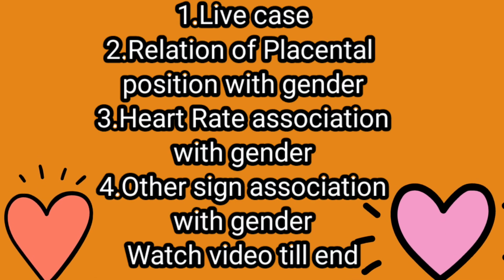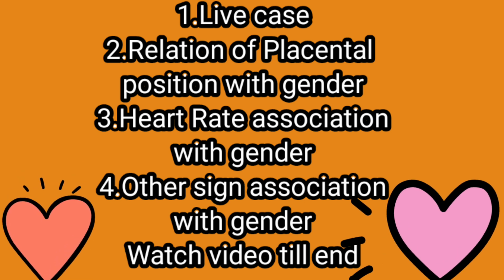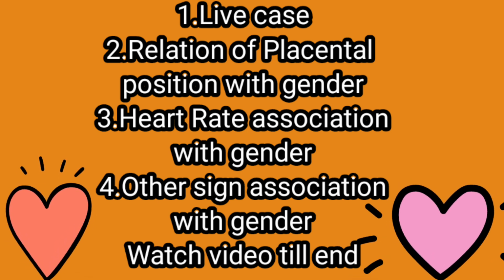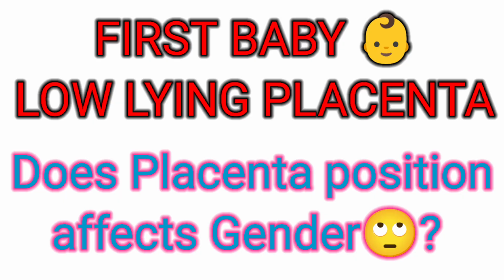In this video, we'd like to discuss the live case, the relationship of the placenta with the gender, heart rate association with the gender, and other signs in pregnancy that are associated with the gender. Please watch the video till the end. It's a very important and interesting video. This is the case of a lady having her first baby with a low-lying placenta. Does placental position affect the gender? We will find this answer in this video.